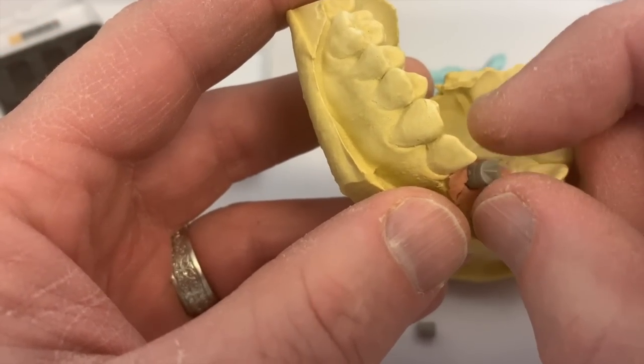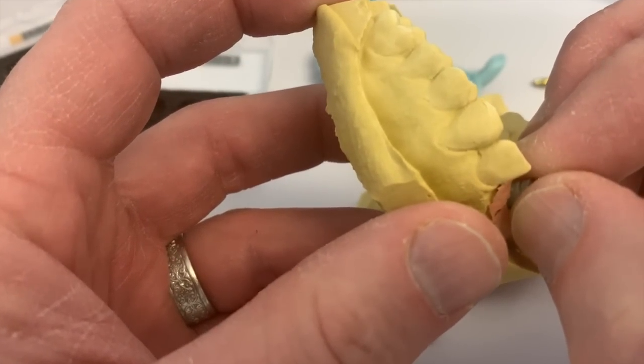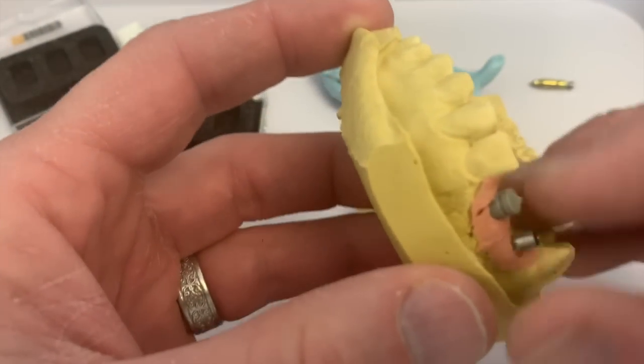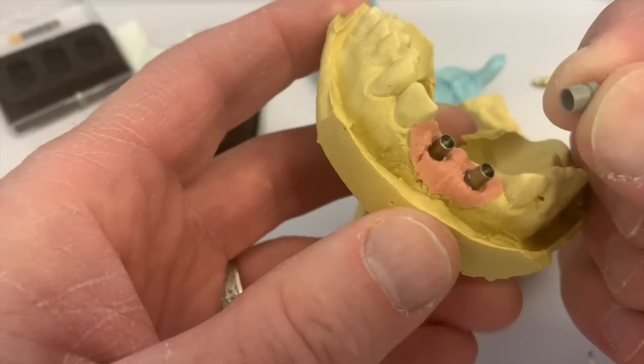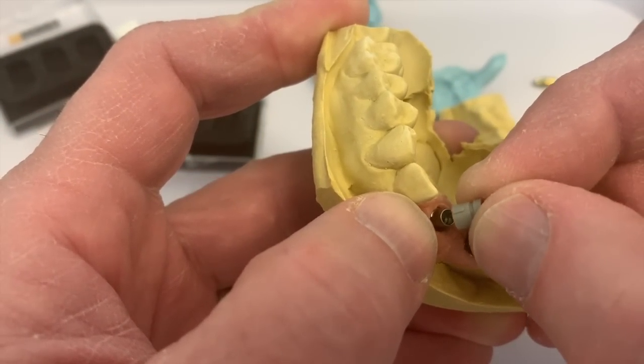That groove is toward, sorry, that's number 9, toward the distal. Now I got other videos that demonstrate this, but I could, if I wanted to, misalign this and force it to place. You can see that notch in there.